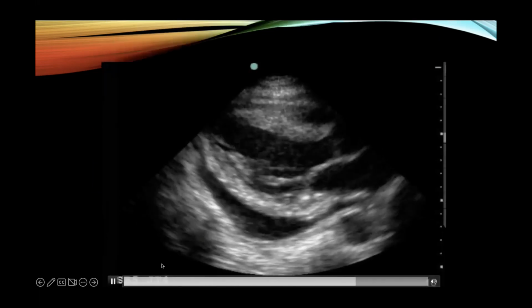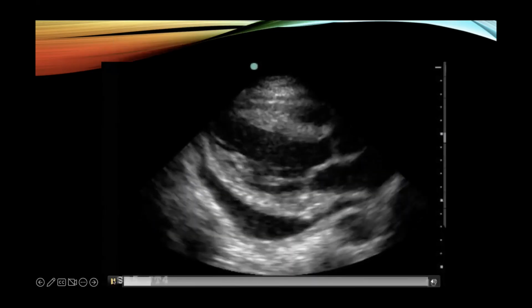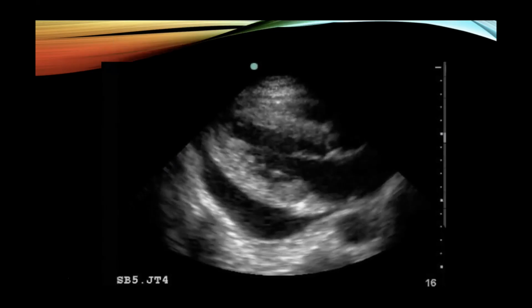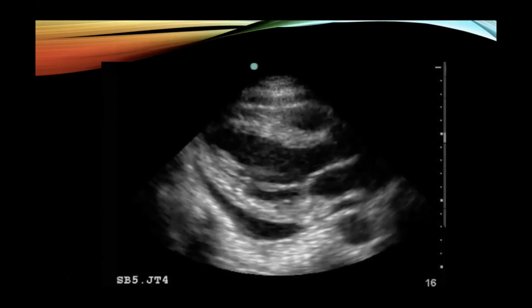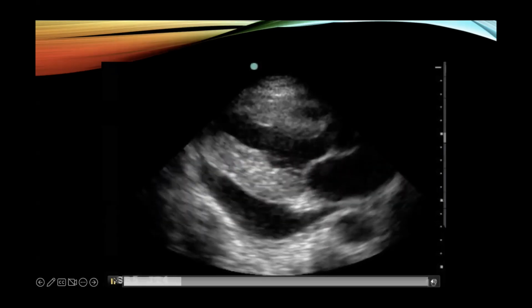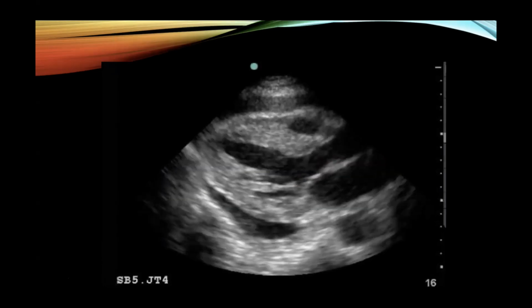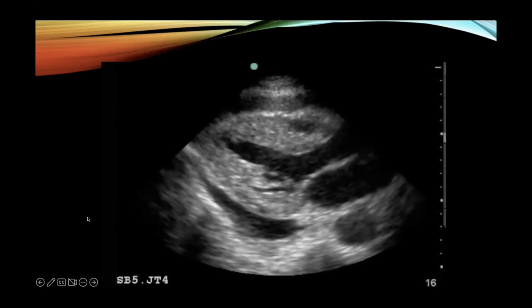Robbie, what do you think about this one? I definitely see fluid crossing over. And it looks almost like the swinging heart picture for some excessive pericardial effusion. Yeah, just like your presentation, right? Tons of fluid around the heart.